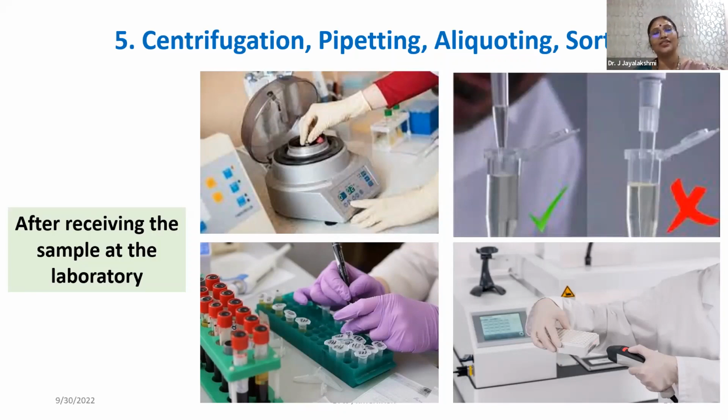Otherwise, it stays as such. These are very small things, but it is important that you capture them appropriately if you have to get your systems in place and your quality improvement procedures in place as well. So that's another area of concern, this turnaround time capturing. Many labs would have issues. Also, when they have weekend errors, that's another thing that you need to worry about. So samples come in when they have to aliquot.